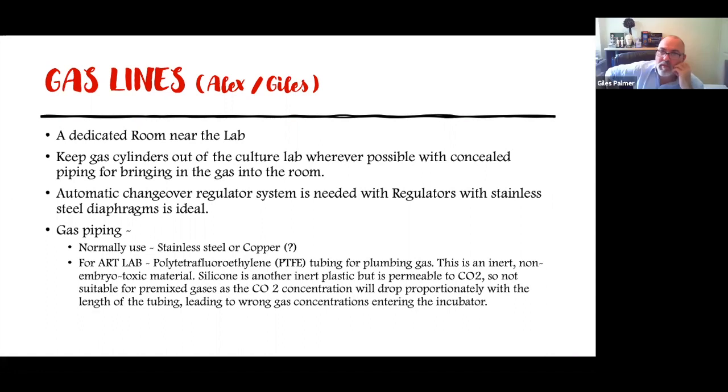Sure, I agree 100%. Not much more to add, but have a separate room for your gas bottles. Have an automatic changeover, of course. I would prefer medical grade stainless steel, the shortest possible route, and make sure that the input to the lab is where you want it so that you can position your incubators very carefully. Have 2 manometers, one for pressure, one to turn off when you're cleaning in there.